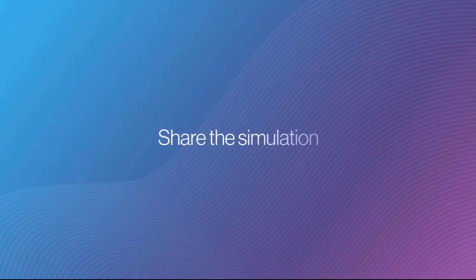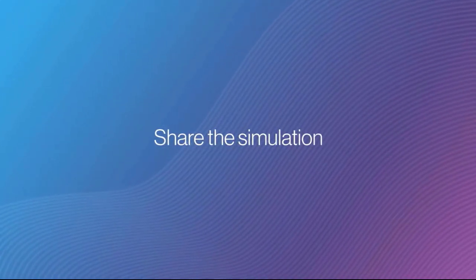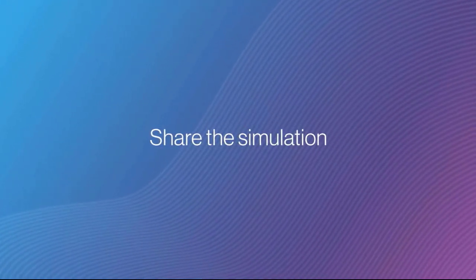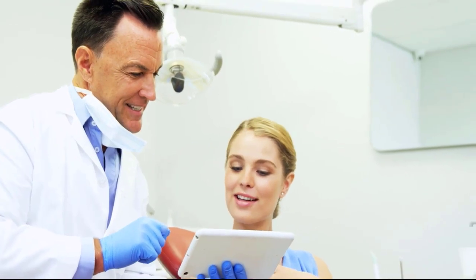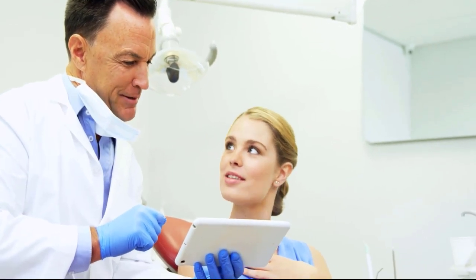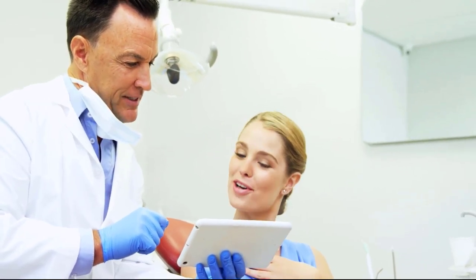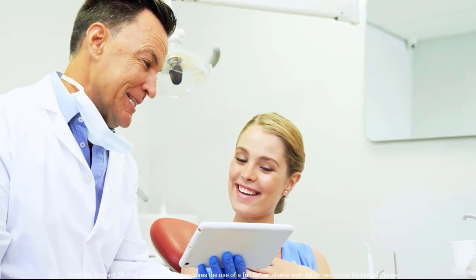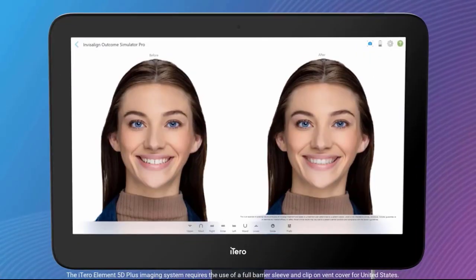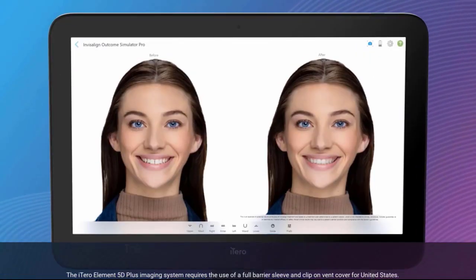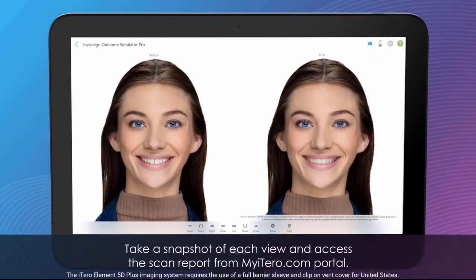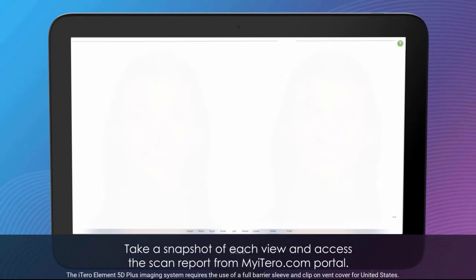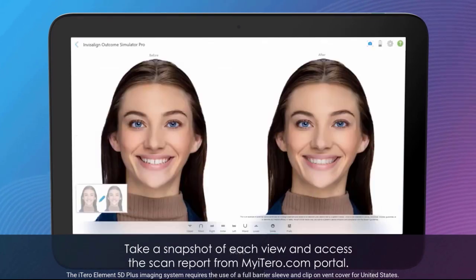Share the simulation. You can share both the potential smile and the 3D model by using the Screenshot tool and the iTero Scan Report. Take a snapshot of each view and access the iTero Scan Report from the myitero.com portal.